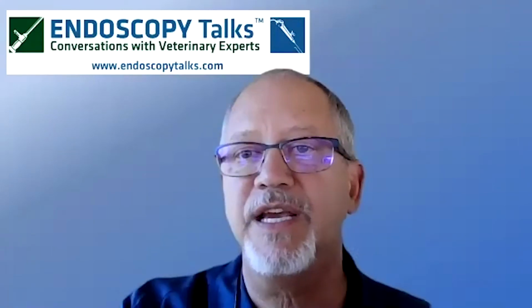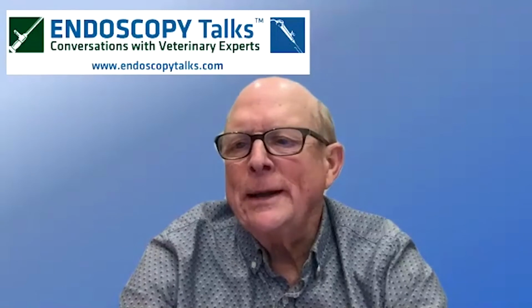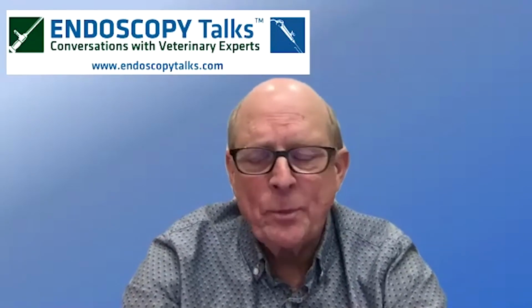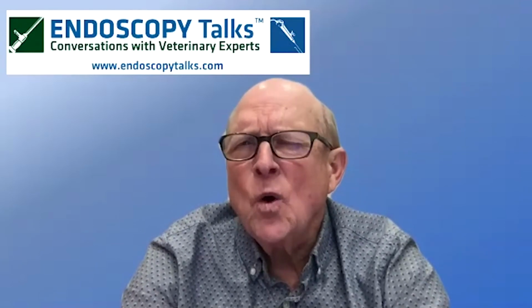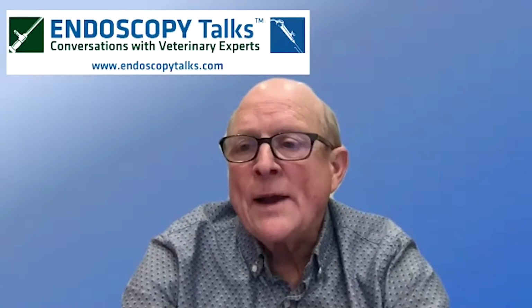All right. Is there a trick to twisting the esophageal foreign body to get it to dislodge? Not really. You fiddle around with it, and you may have to push it in a little bit and try turning. There's no real specific trick. If you have a good, strong pair of graspers, that's relatively easy to do.